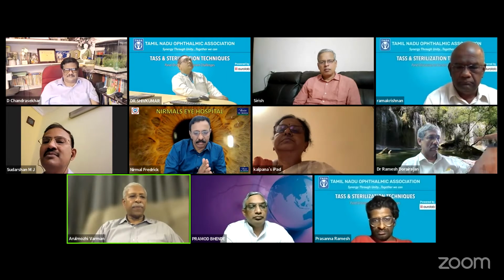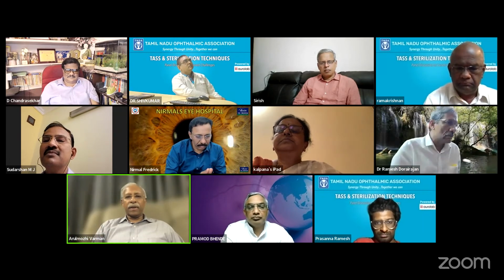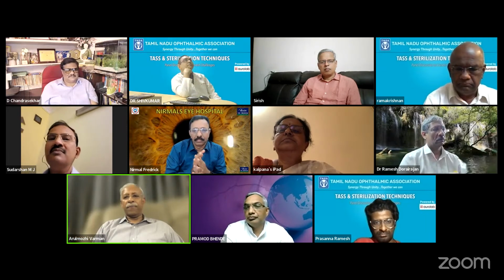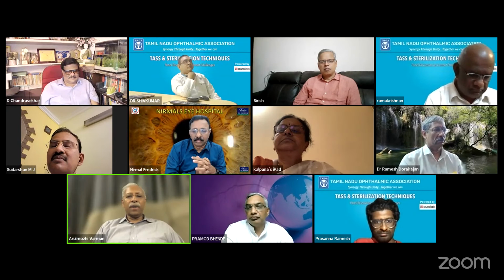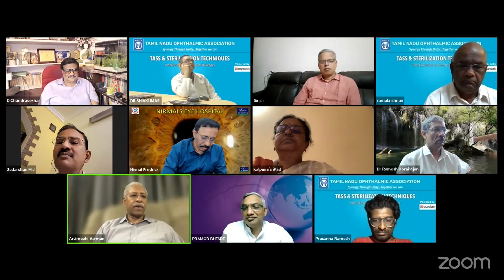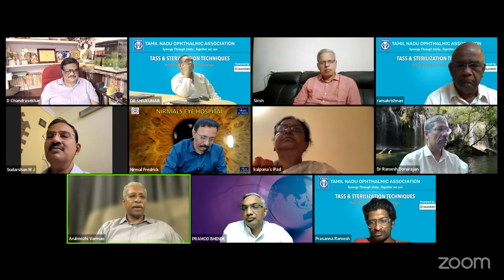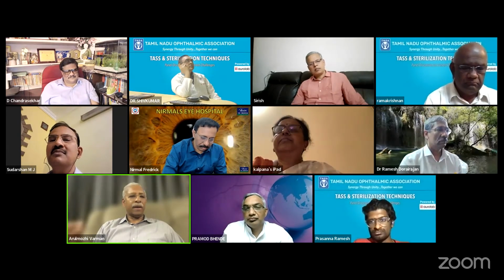It should be dried. You should use a simple hair dryer to completely dry out all the instruments, and then use a filtered air gun to blow dry all the instruments and all the hollow instruments that you reuse. Reuse as few hollow instruments as possible. Throw away all the cannulas after single use and use disposable cannulas. Probably the only hollow instruments you will end up using would be the IA tip and the phaco handpieces. Blow dry them cleanly and thoroughly.